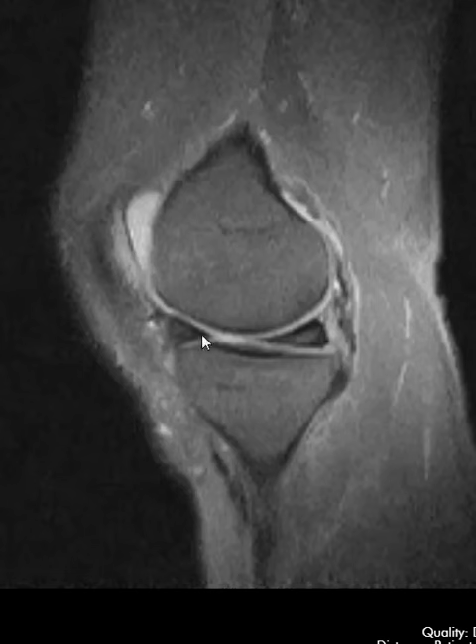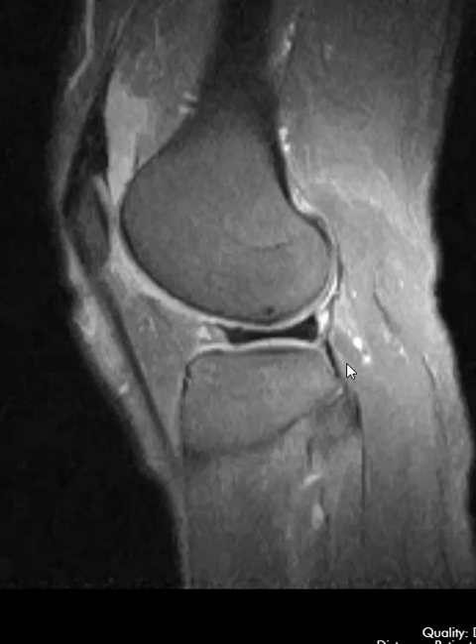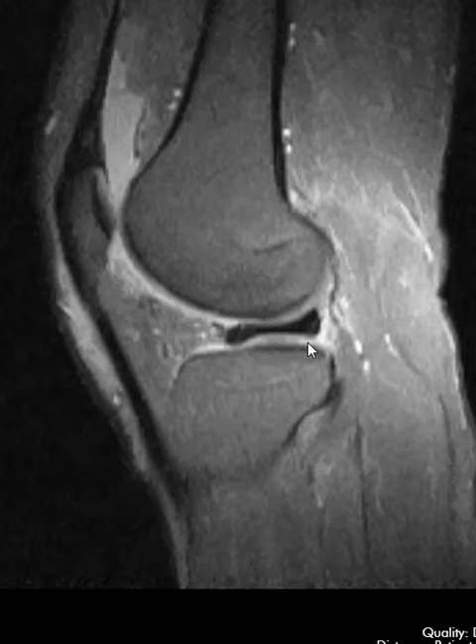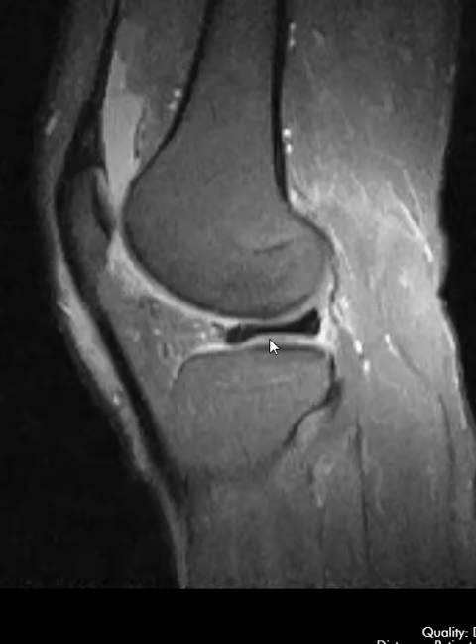Now if we go to the lateral meniscus with the discoid configuration, we see the meniscus here. We go towards the middle a little bit and we see it just as big — it never comes down to that pointy part. We go one more cut; this is the very inner side, so it never has a pointed inner margin. Just a big broad disc-like meniscus. So again this is called a discoid lateral meniscus.